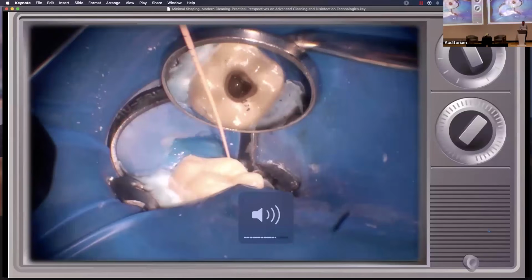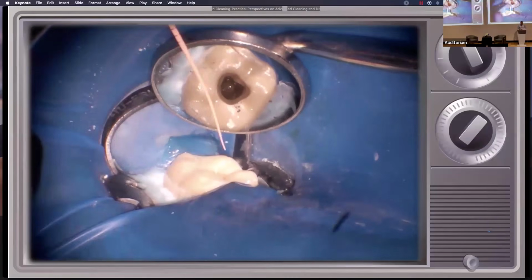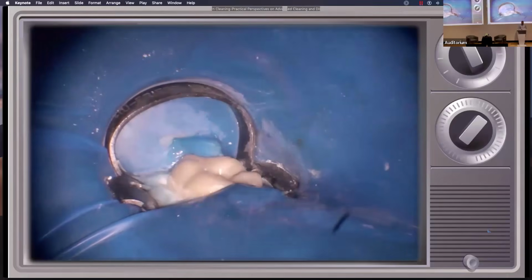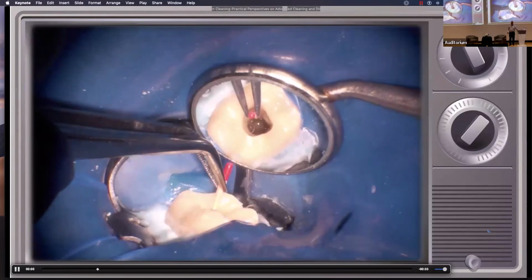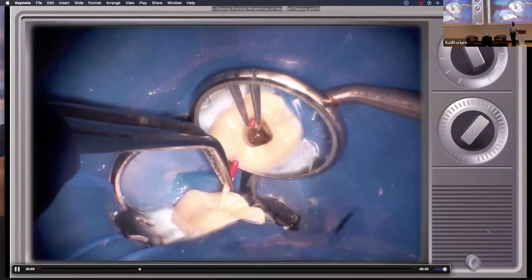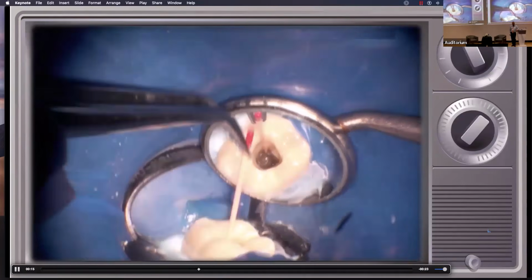This cone now, I've trimmed about a millimeter off the tip. So I cut that ML cone to length still, and no crinkle on that one. So that's good. So I'm going to mark that at 23. So here's the MB, same size cone, and I trimmed a millimeter off, and that's going to 22, so it's really only like 21. So whatever the natural shape was in this canal, because we didn't really impart much natural shape, it's not taking that larger cone, so we're going to have to drop back down to a 17.